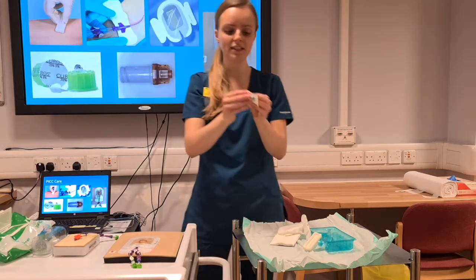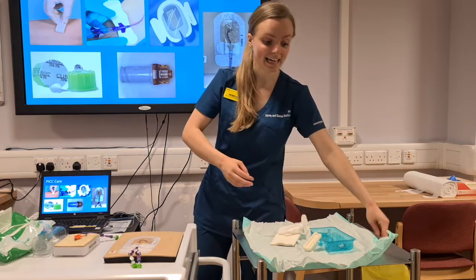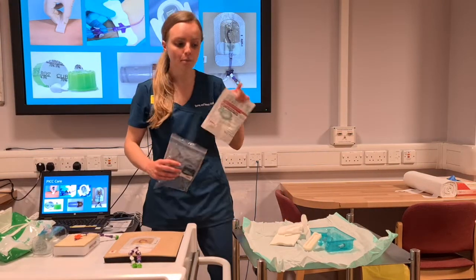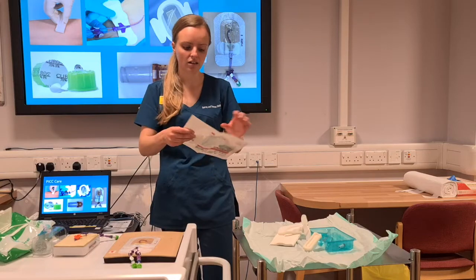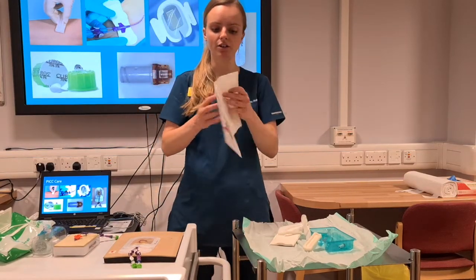I've previously stated that BioNectars help with reducing infections and also air embolisms. Every time you change the dressing, you must change the BioNectar. Underneath the BioNectar, especially if you're using certain medications, it can get not very nice. So we want to give it a really good clean and a good freshen up.